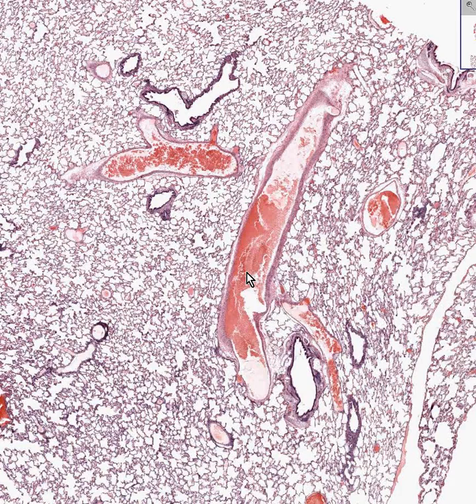are the vascular spaces, going from a pretty good thick-sized pulmonary artery down to smaller arterial branches, and of course veins, which would have even a thinner wall than the artery. But remember, the pulmonary artery system has a low arterial pressure, so the arteries here aren't quite as thick as you'd expect them to be.